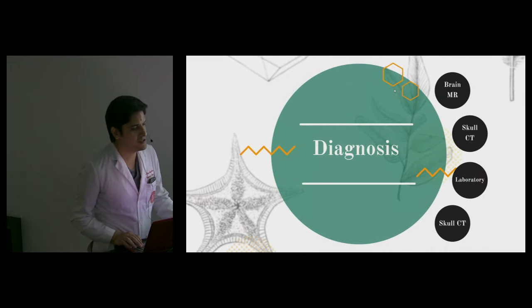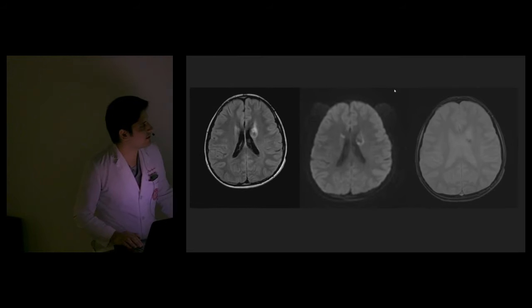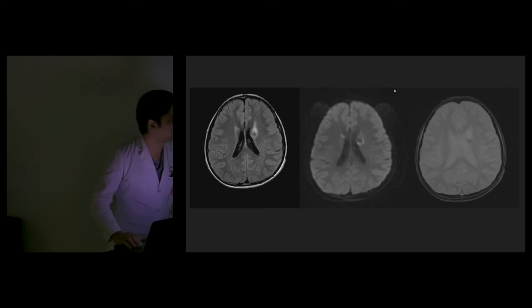Well, this patient came to us and we ordered, well, this is the MR of the patient that had traveled to Nuevo Laredo.